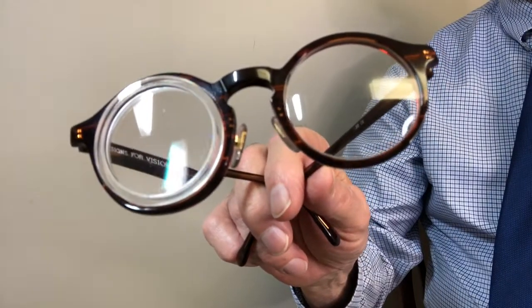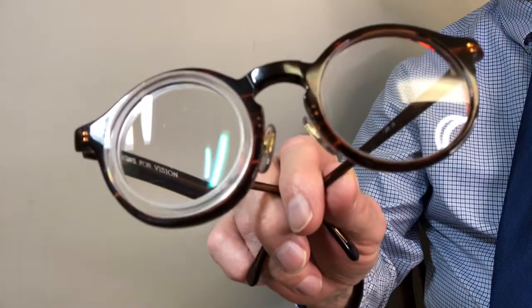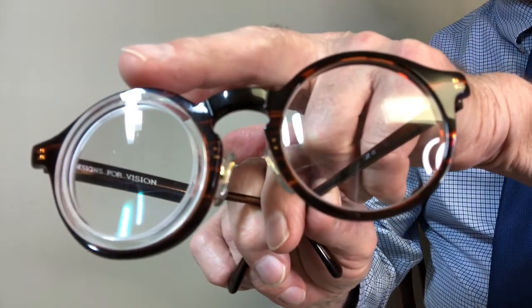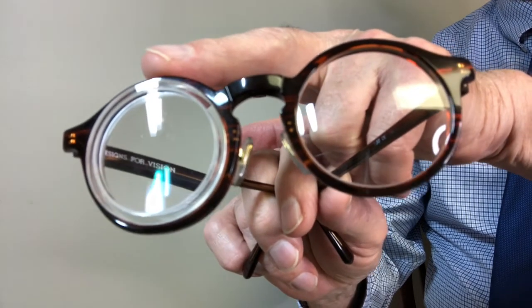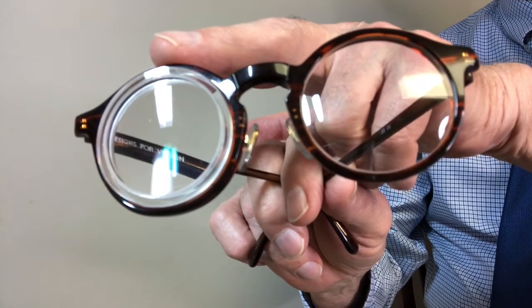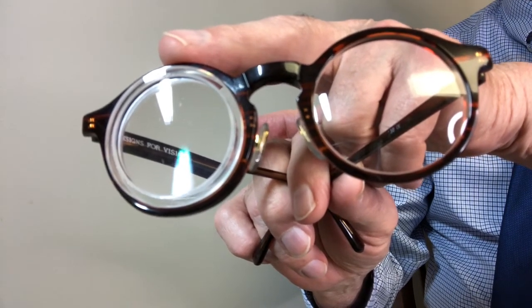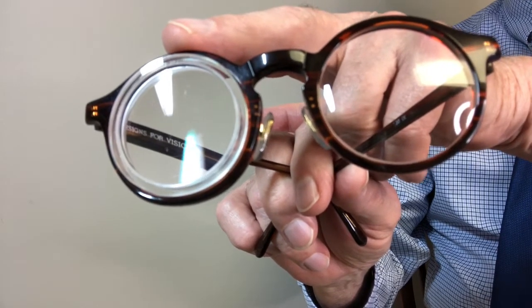These are microscopic glasses. They can be used for more complicated prescriptions than the prismatics, and this is the microscopic lens, and it focuses quite close, has better quality focus than the prismatics do in most situations. So these are microscopic glasses used for reading and other close activities, focusing between perhaps 10 inches and 3 or 4 inches, depending on the power.